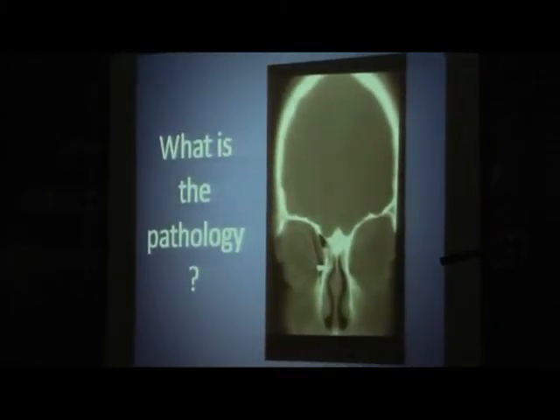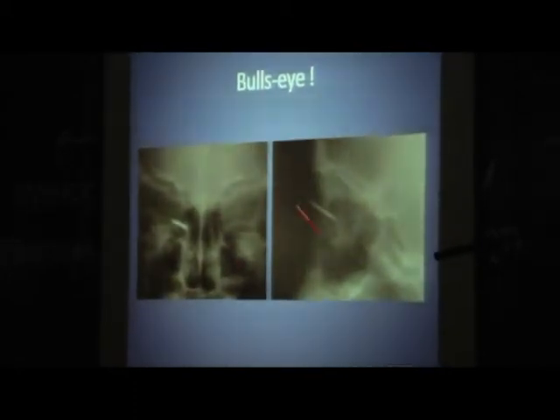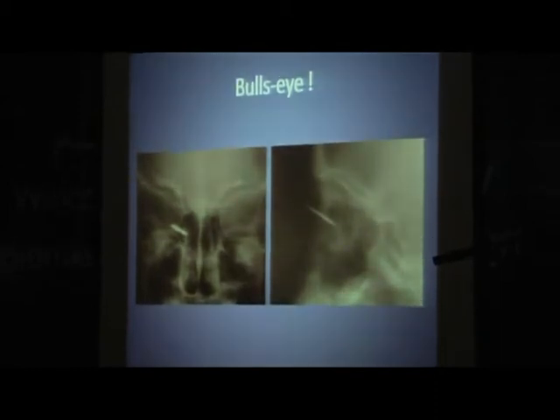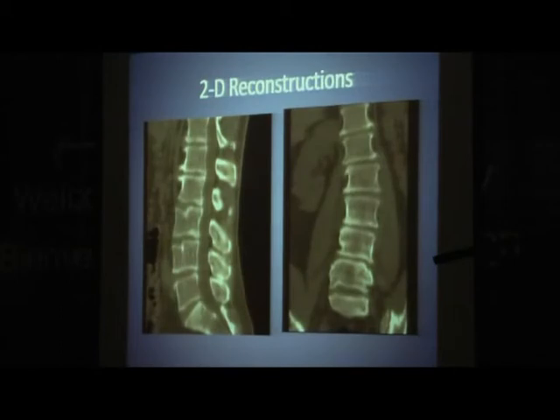Anybody see the pathology here? Okay. No, it's a little dark. And you can see he's lucky it didn't hit his orbits, it just went. It's right by the nasolacrimal duct.